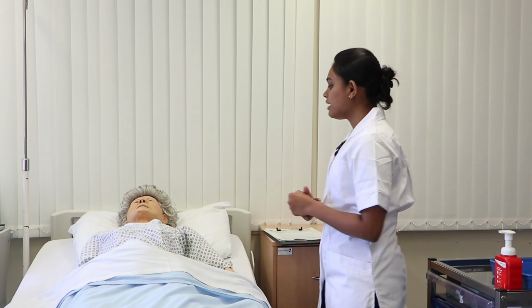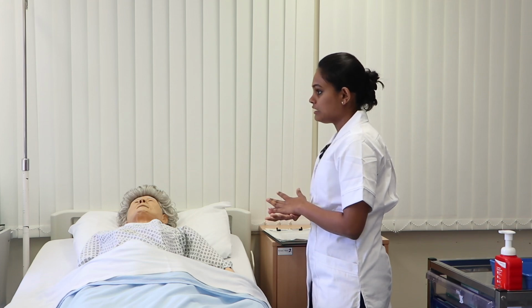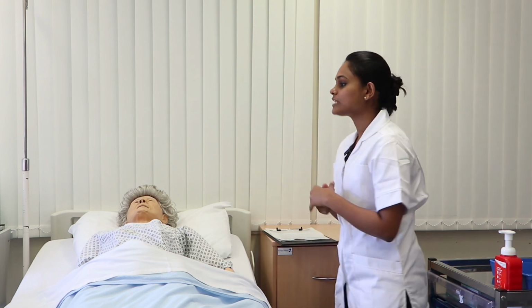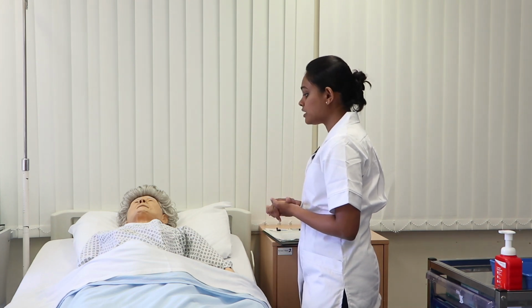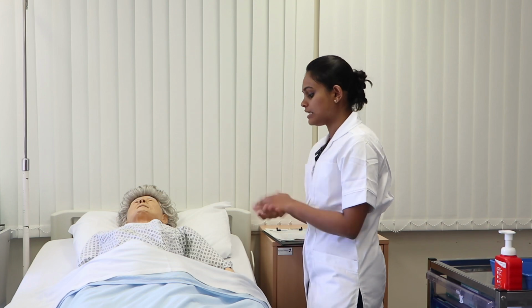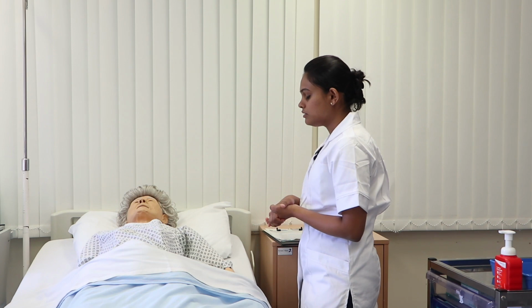And Grace, today I am here to remove your catheter, and that is called trial without catheter. You may feel some post-catheter symptoms such as urgency, frequency, and discomfort due to the irritation of the urethra. But you don't worry, I am going to monitor you. And while removing the catheter, I want to expose your genitals. So, do you need any chaperone?